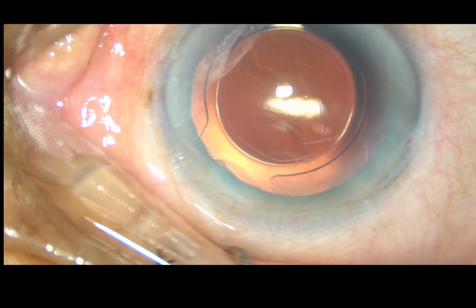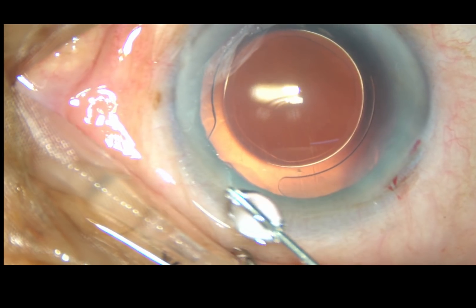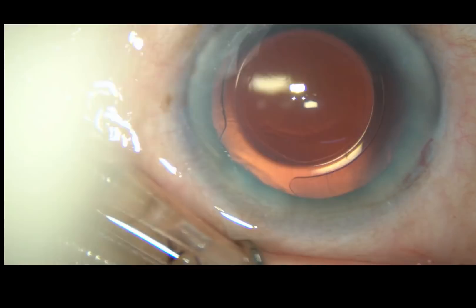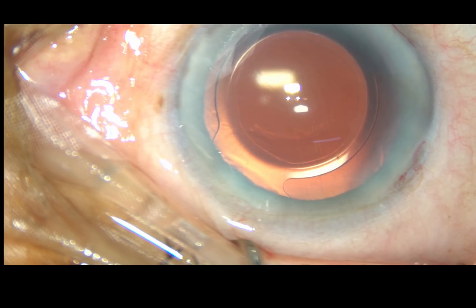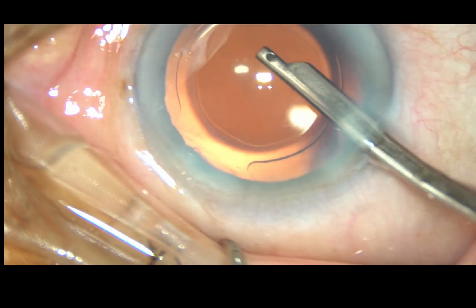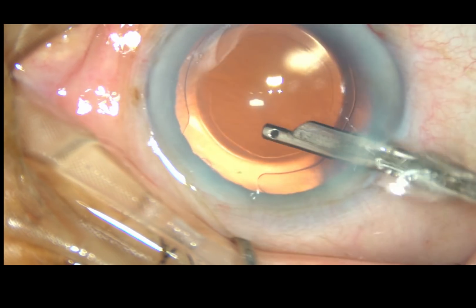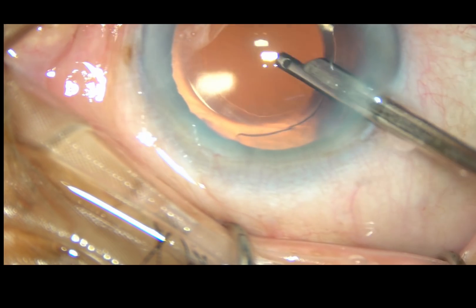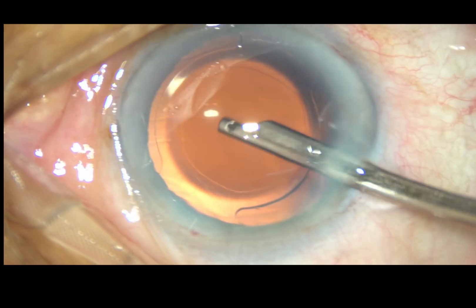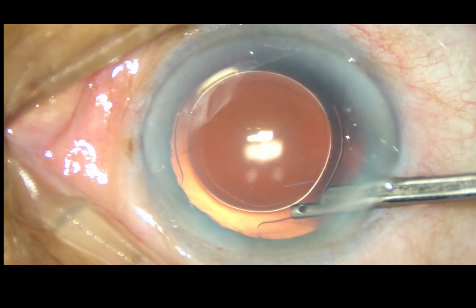This is a bit of moxifloxacin added. Now the side ports are hydrated — they are nicely hydrated so that these stab wounds become watertight. This is the final lavage of the anterior chamber. Irrigation is also done through the aspirating port for a few seconds, and whatever viscoelastic substance is sticking to the corneal endothelium comes out. The anterior chamber is nicely formed and the case is concluded.